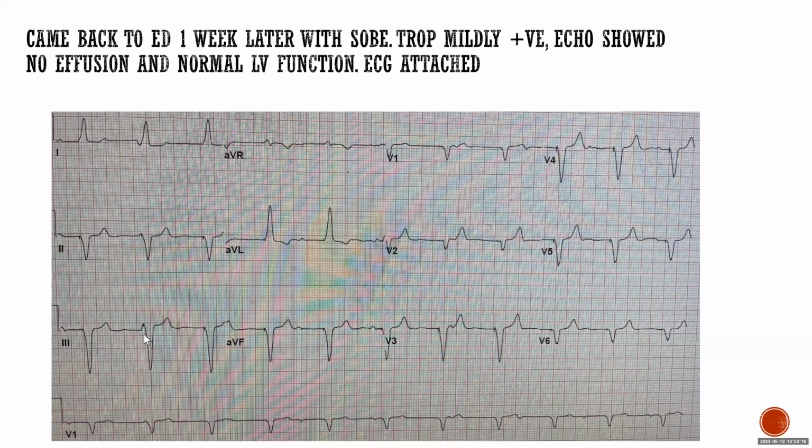That's a good observation, Bilal. Nothing actually happening. It's just the P is following exactly where the QRS is starting. So it appears as if the spike is within the QRS, but it's actually not. It's a P wave buried in the initial portion of the QRS. Good observation.